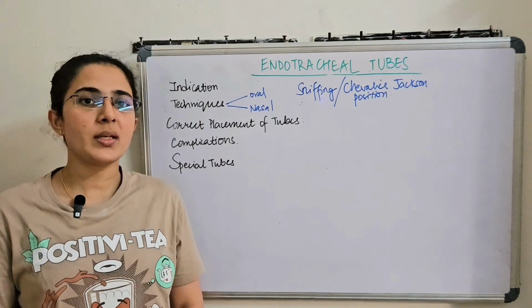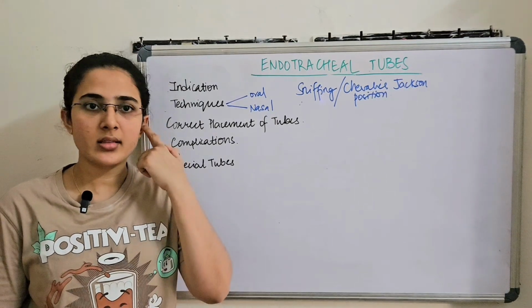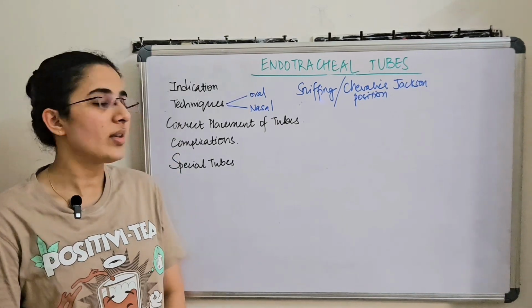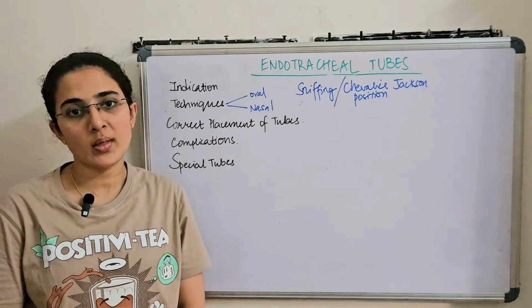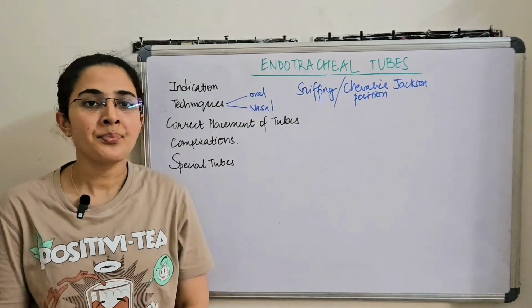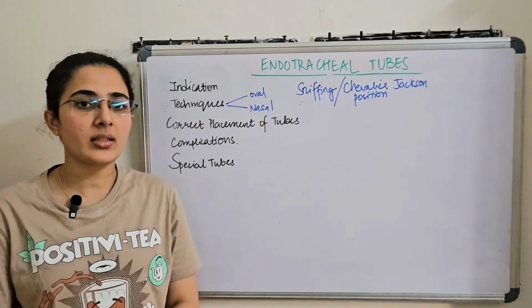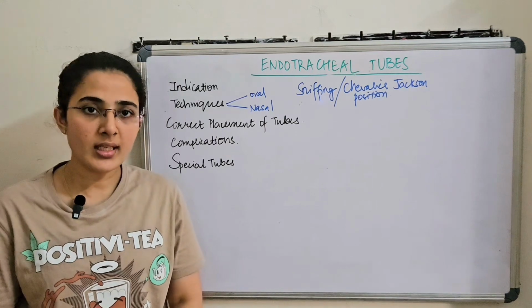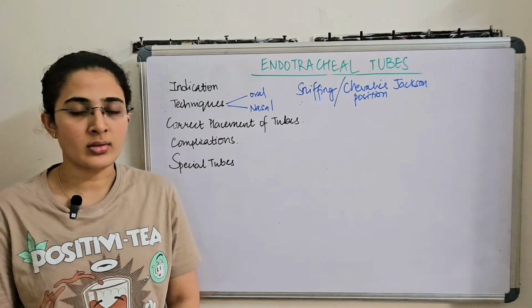In obese patients, we mainly see that the sternum and the external auditory canal come to be in a straight line when they are lying down. So this is the positioning and how it's done. In an oral intubation, we usually use a laryngoscope to push, or sweep, the tongue from the right side of the mouth to the left, visualize the cords, and do the endotracheal intubation.